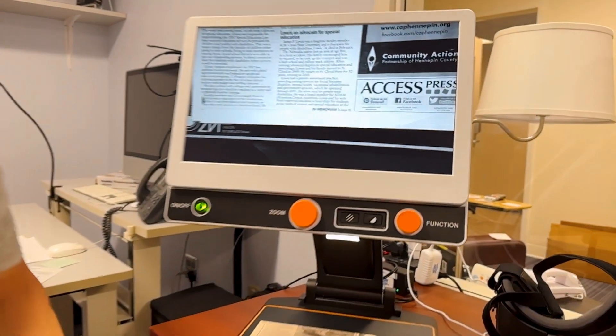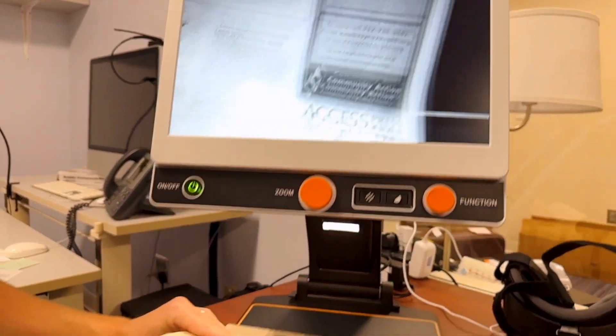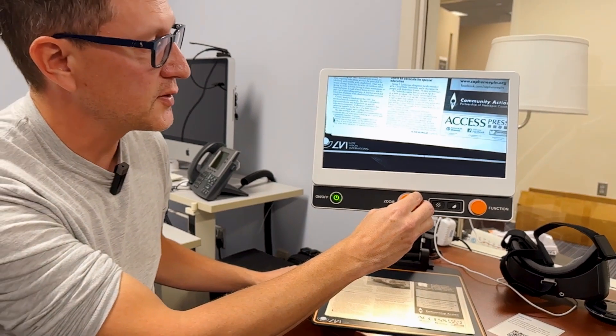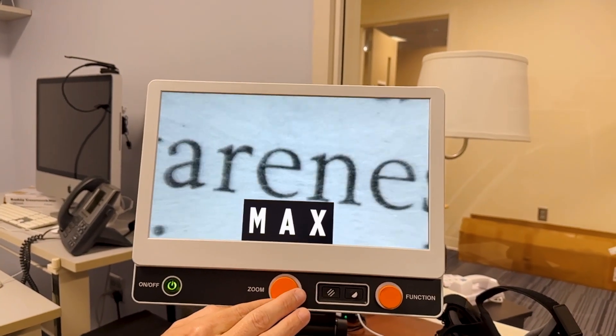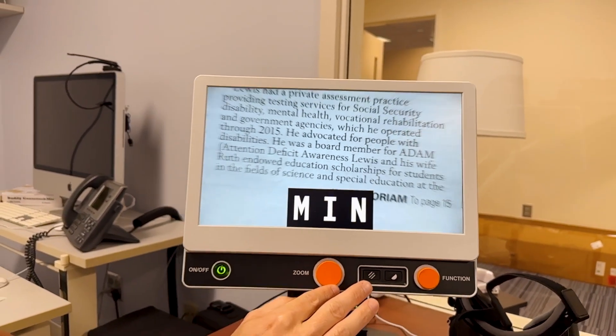This is a nice big screen that will zoom into any text. So if you wanted to read your local paper and it might be a little struggle to read those fine print, you can zoom in pretty close with this thing and zoom out to whatever you're comfortable with.